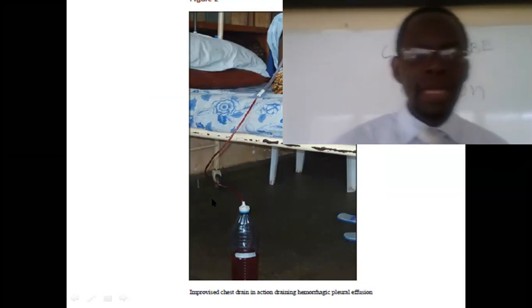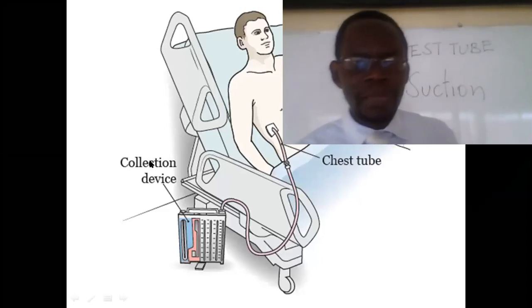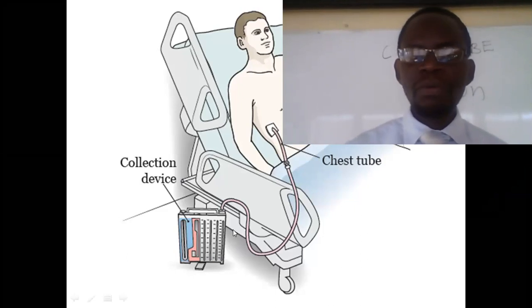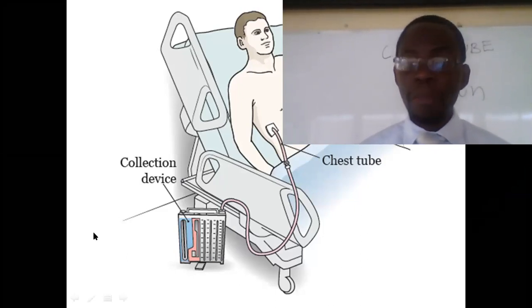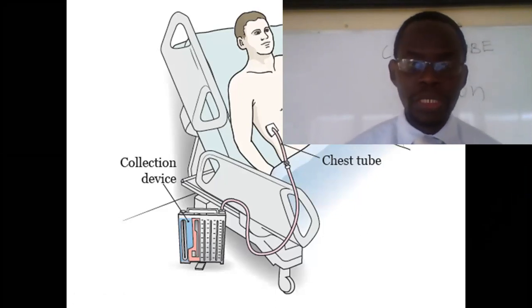Now the other one, the collection chamber, as you can see in this diagram, is the commercial one that is actually sold outside.